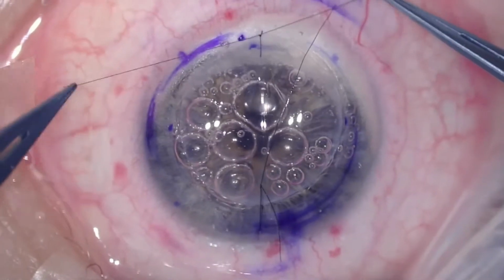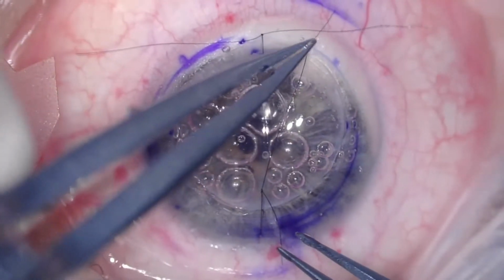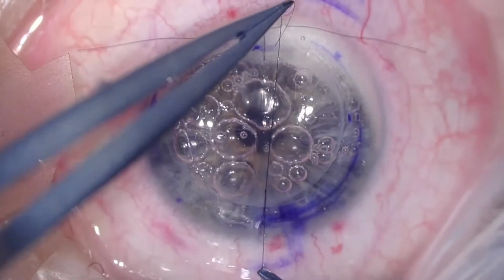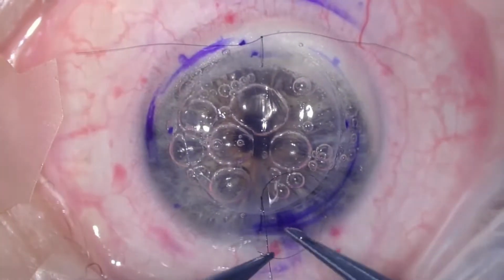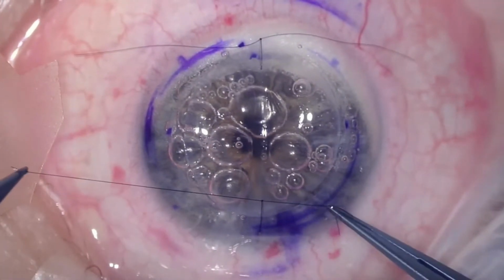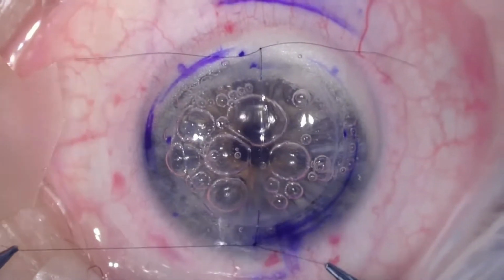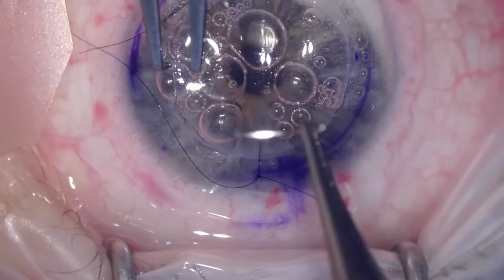So here I'm just doing the full 4 throws, trying not to over tighten, and now I'm going back to the first suture, first cardinal, and I'm tightening that again. So this has not been completed, I'm completing it now. This gives you that vertical line that you're seeing, dividing the cornea into half, and it allows me to adjust the tension a bit more than just tying the first stitch first and then doing the second stitch.